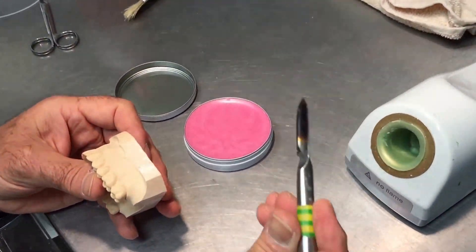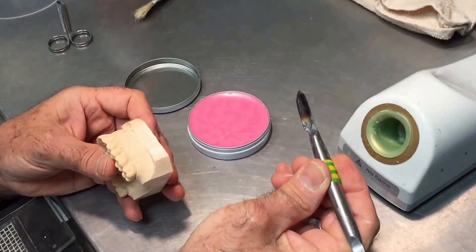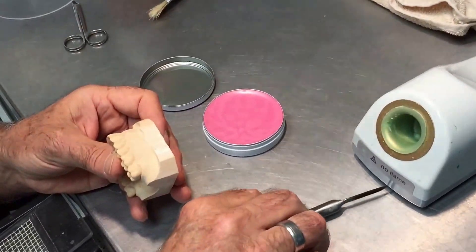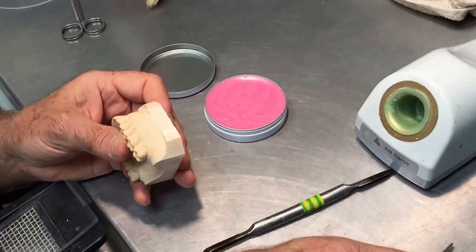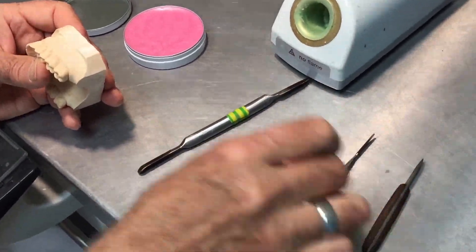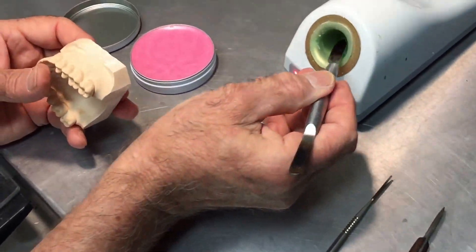I like to use a large instrument — my large wax knife — because it carries the heat better with the Thermo Wax, which is a slightly higher temperature wax. If I were to use my Lacron or a smaller wax knife, they don't carry the heat as well, and this material requires slightly more heat than a modeling wax.